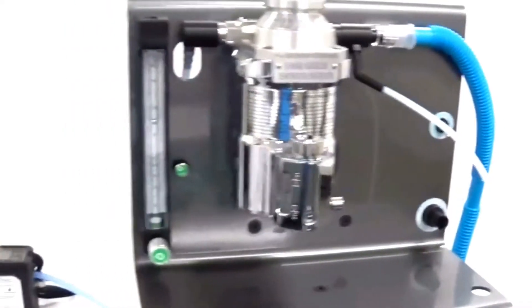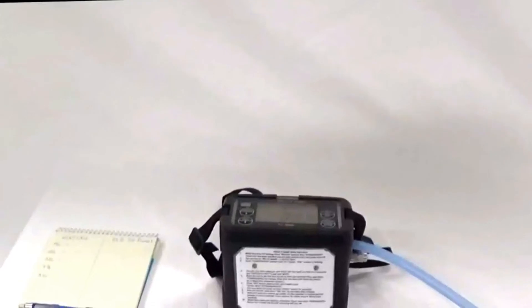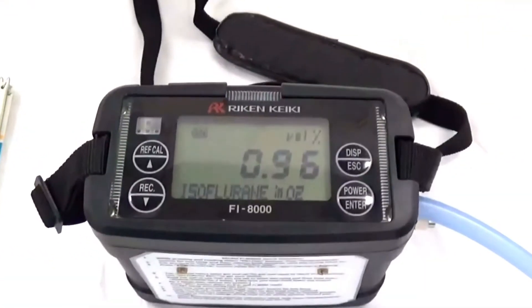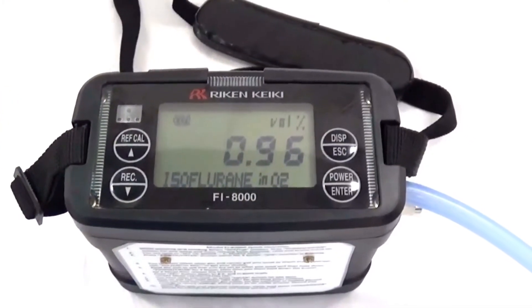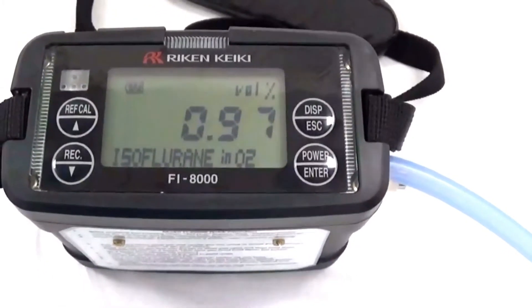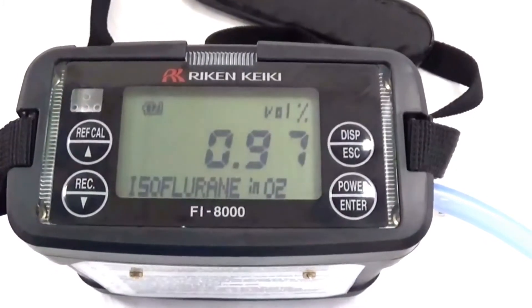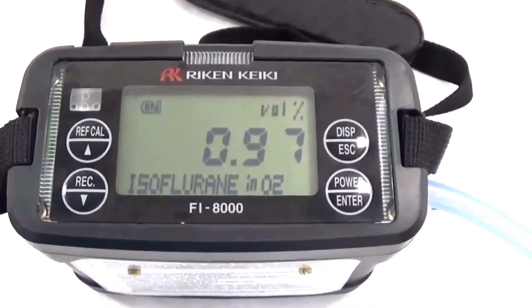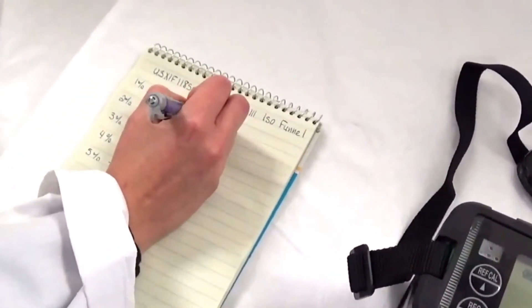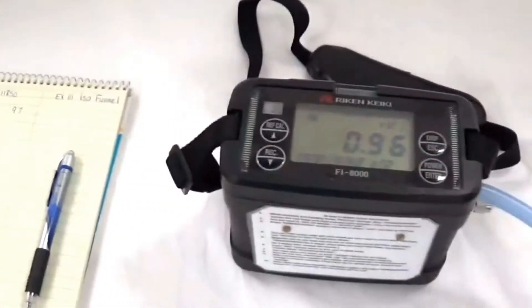We are now ready to start verifying the output. On this particular unit the pump runs constantly, so there is no need to turn the pump on and off. The output numbers are already there — wait until they stabilize and take your reading. In this case they are already stabilized at 0.97%. We will record this value and also make sure you document the serial number and model of the vaporizer.